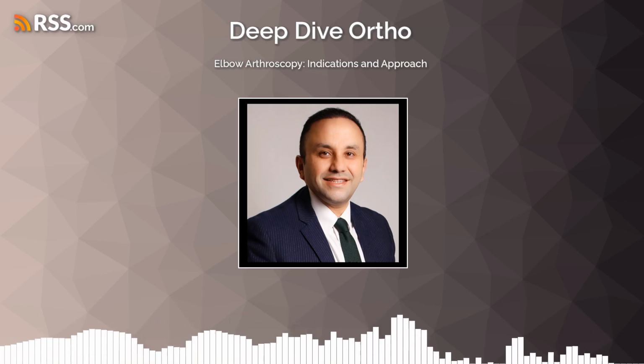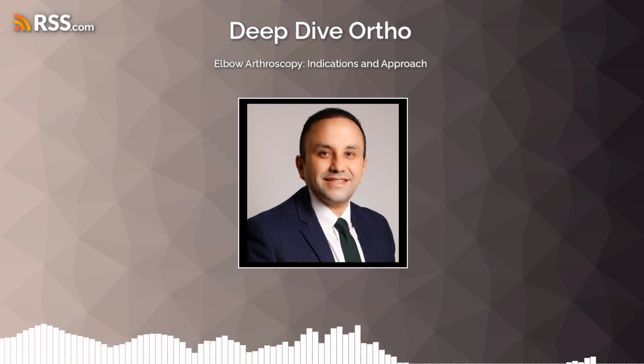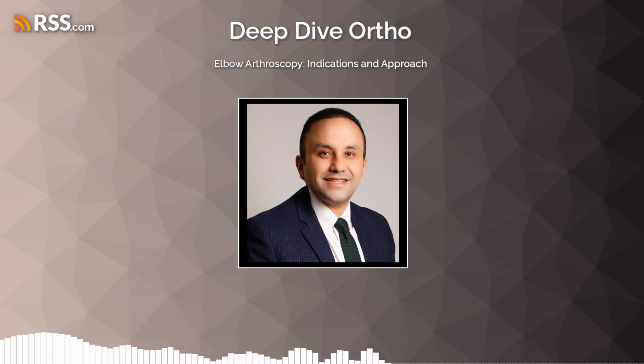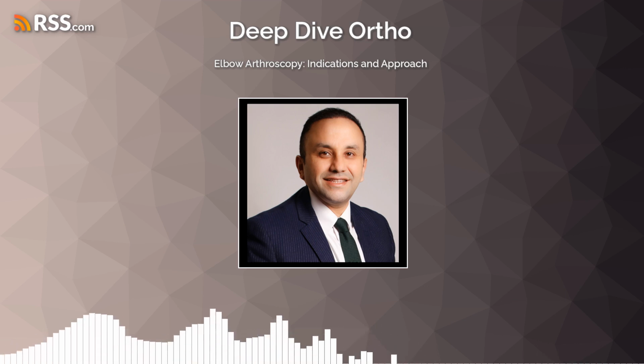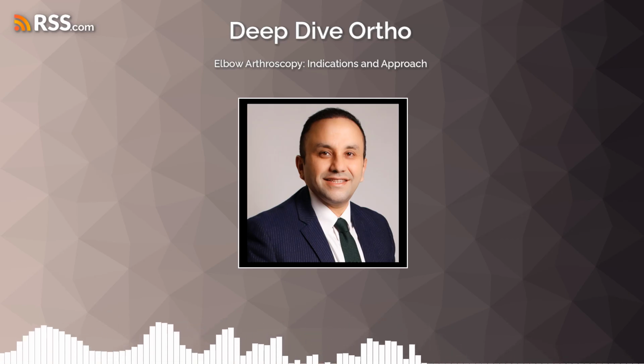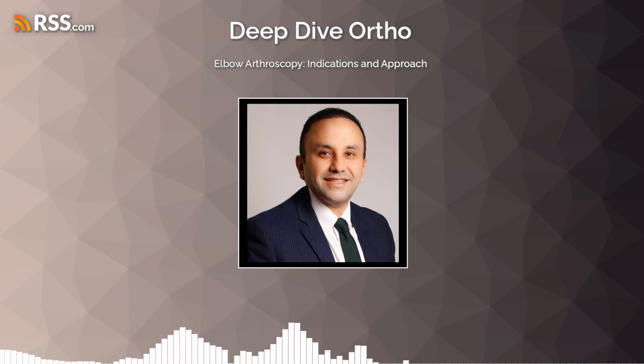A 70-degree arthroscope can be particularly advantageous here, providing a more complete panoramic visualization of critical areas like the coronoid fossa, any potential loose bodies lurking in the anterior joint, the posterolateral and posteromedial gutters, and the olecranon fossa and radiocapitellar joint posteriorly. That wider view must be incredibly helpful.